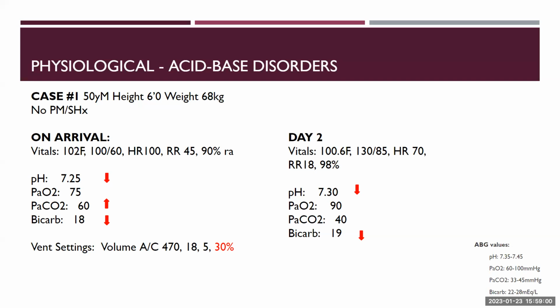Jessica, why do you think it's not perfect? I guess I would still expect him to be breathing off a bit more CO2, with a bicarb of 19. That's a good point. No, it was not a trick question.